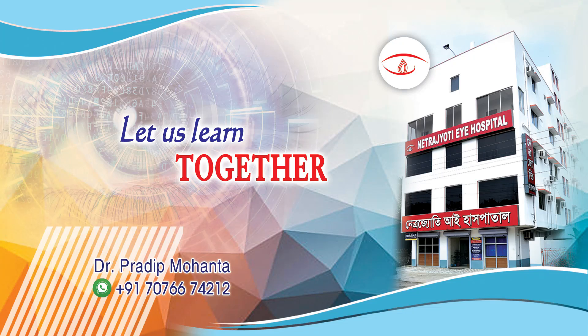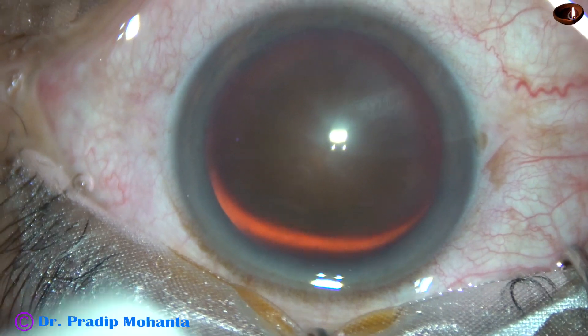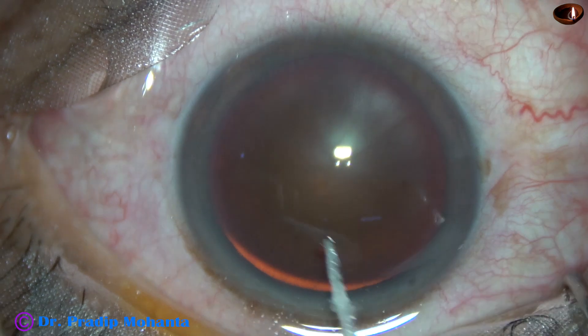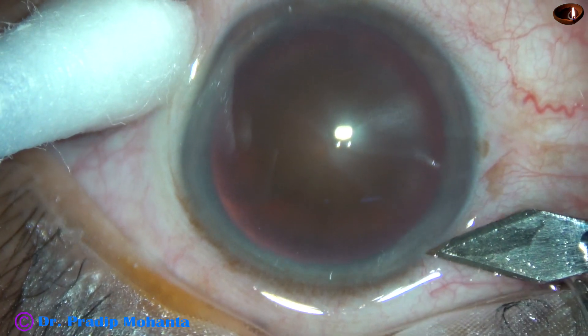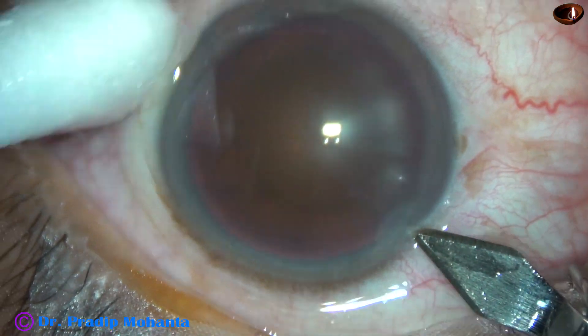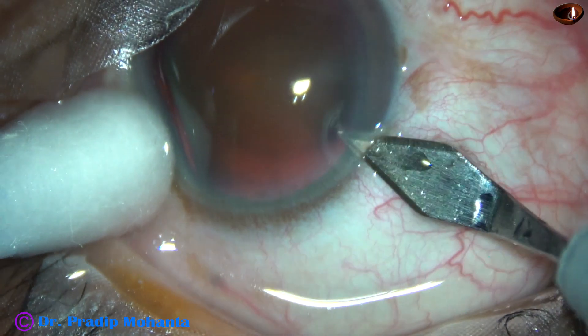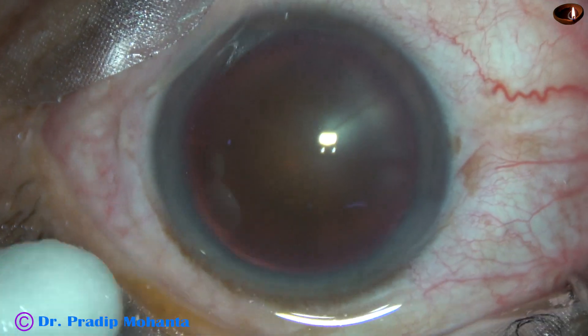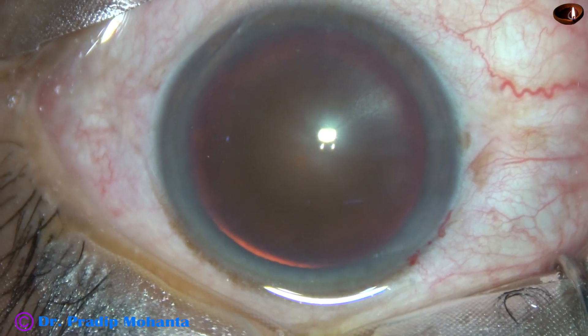Friends, welcome to my workplace at Ranakh Heart, West Bengal, India. This is a totally unedited recording of phacoemulsification of this hard brown cataract. This is a really hard cataract with nucleus sclerosis of about grade 5, or even harder than that.